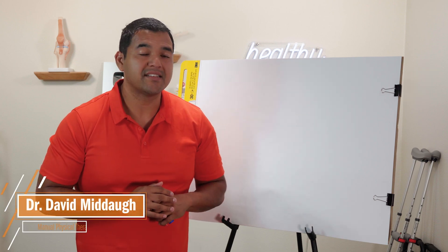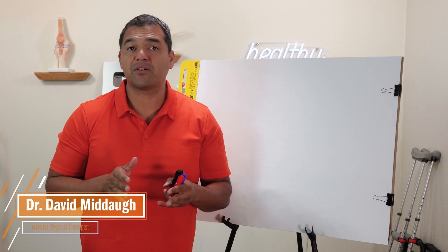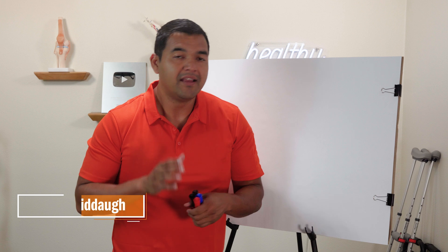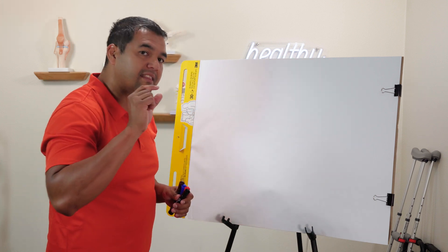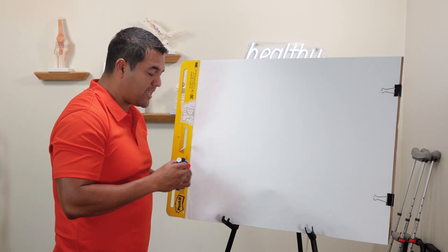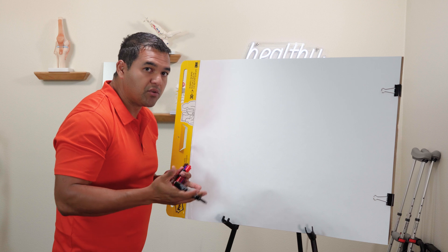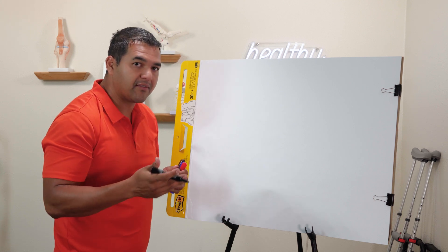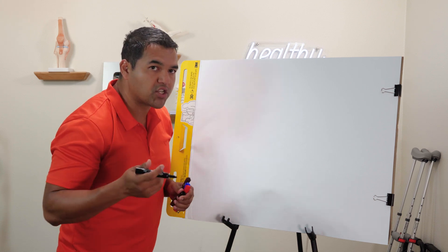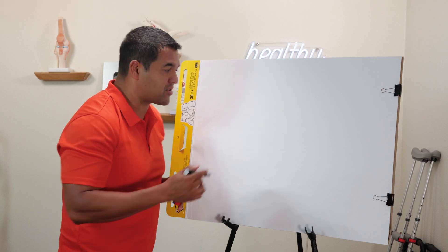Here's the ACL tear grading system explained so that you can better understand your MRI. The MRI is looking at the ACL inside your knee and the degree to which it's torn so that they can determine the severity of the tear and figure out what treatment you need, especially if you need surgery.